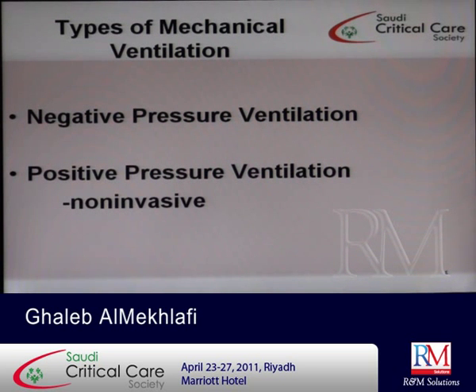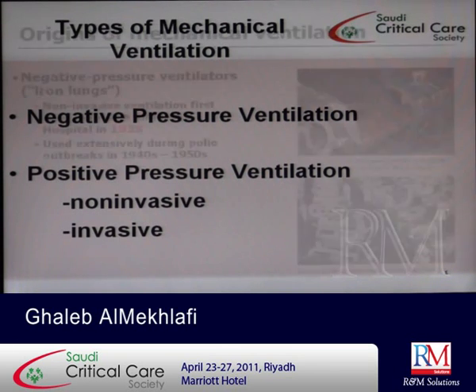If we are using a mask and we are using the normal airway passage of the patient, this is non-invasive because we are not introducing any tool into the body. Okay. So positive pressure ventilation is non-invasive and invasive. I'm going to talk about the invasive first, and at the end we'll talk about the non-invasive.